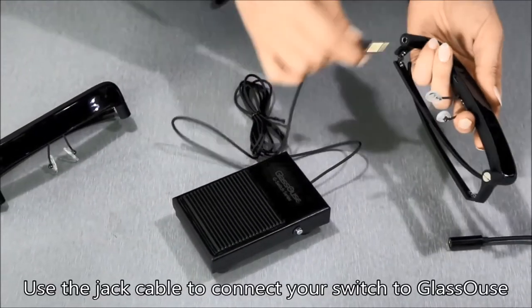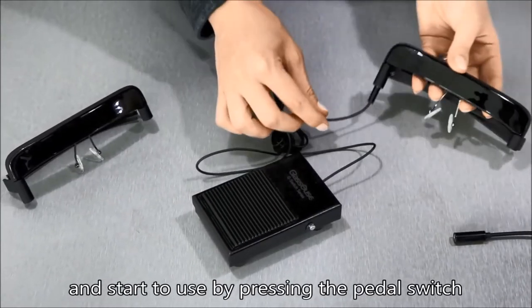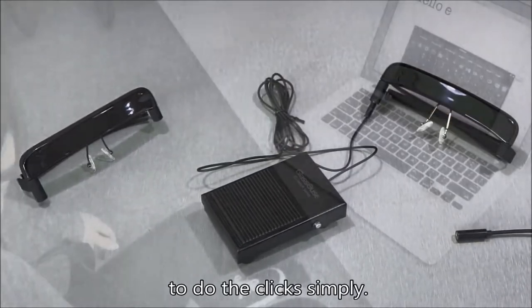Use the jack cable to connect your switch to GlassOuse and start to use by pressing the pedal switch to do the clicks simply.